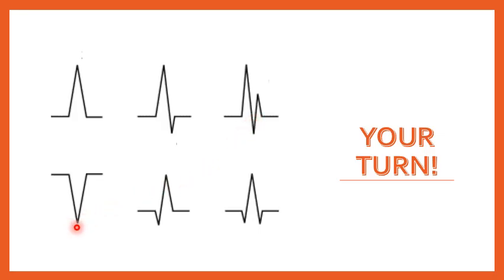This big one here, what we notice about this QRS complex is that there is no R wave whatsoever. This is one big Q wave, or merged. You can call it a QS wave. Q merges with the S, indicating that there are no positive deflections of that Q wave. Then last but not least, over here we have what's called a QR. Would you agree with that? Because we have a negative deflection and we have a positive deflection, QR.